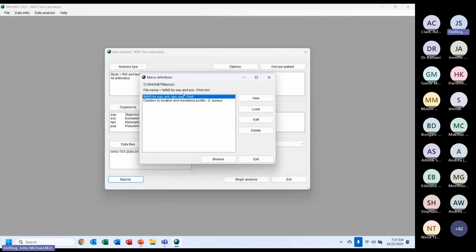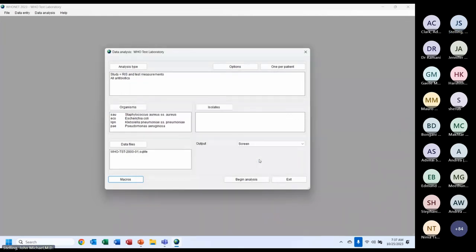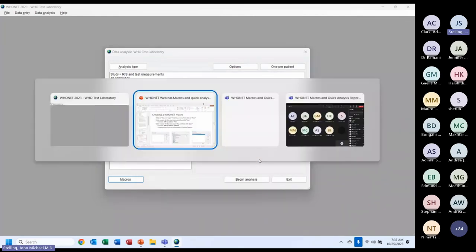There is one small problem with the edited macro — the macro name at the top still says '%RIS, Staph aureus and E. coli' even though I added organisms. If you want to change the macro name, you can't do it there, but you can go to Windows and change the name of the file. I'll click Exit and return to the PowerPoint.